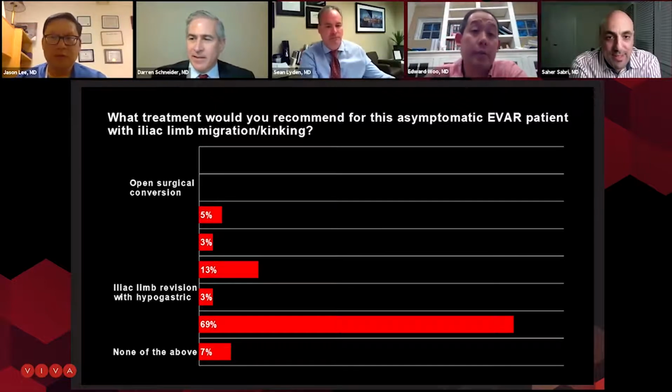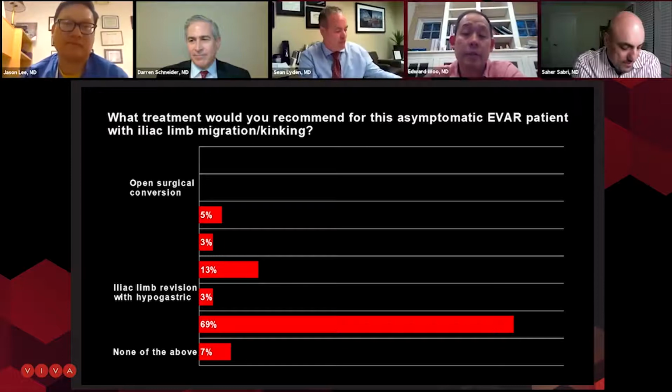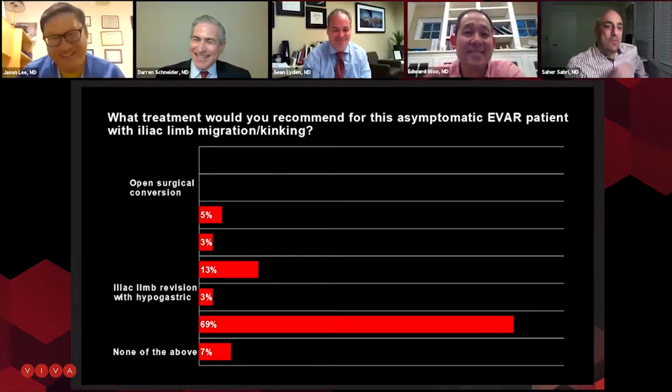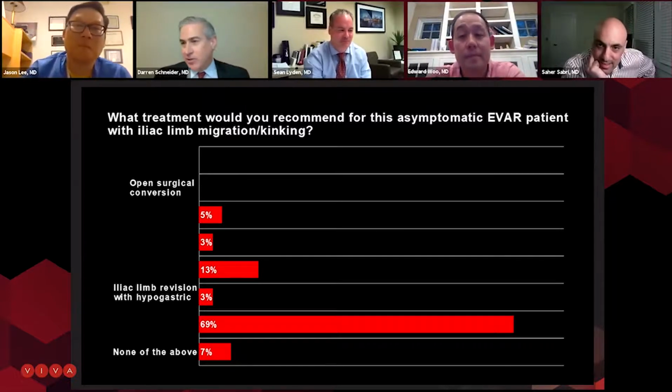So I was just going to say, once you get that stiff wire in, and typically a lot of times we'll do it through and through, oftentimes they'll just straighten right up. Yeah, I was going to say that this one wasn't that easy. Through and through access will help a great deal, I guess. Yeah. So I agree. I think that's a concern, and that played into our strategy for what we did here.